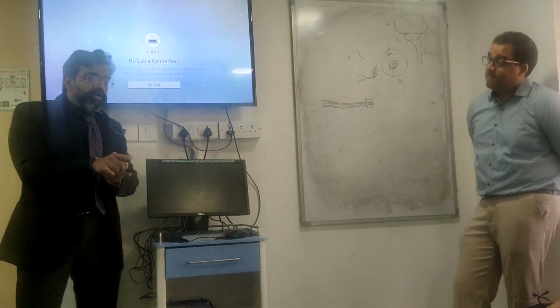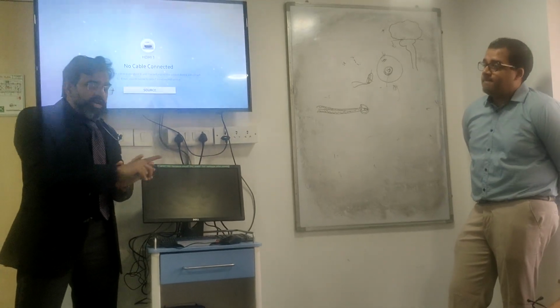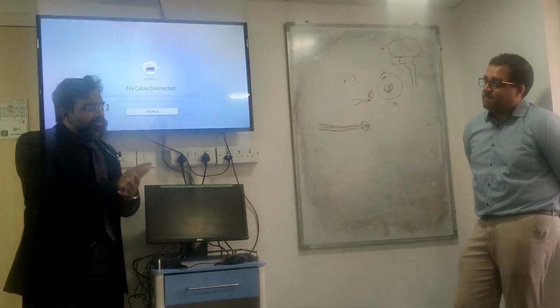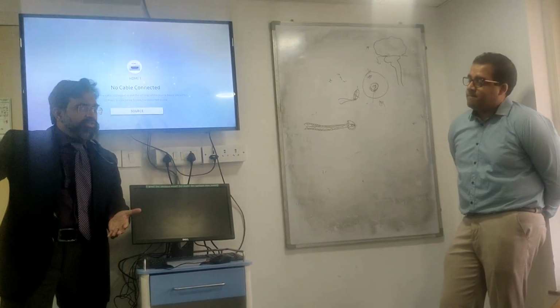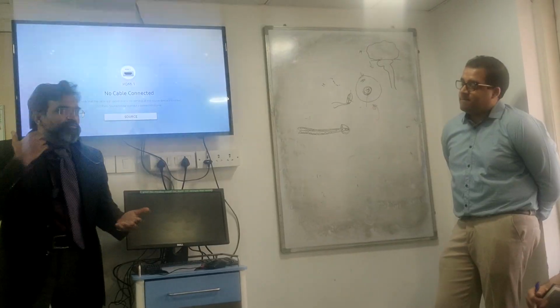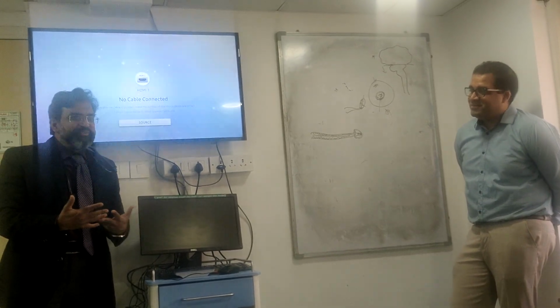And if you're doing it, ensure that you explain to the nurse. We have a lot of attrition among nurses, as the doctor clearly mentioned. It has to be done the right way. The moment it's done the wrong way, everything goes down the drain. The other day I was suspecting a CLABSI in this patient over here, and the nurses sent one from the arterial line and one from the central line. Oh, what do I do? What do I do with that?